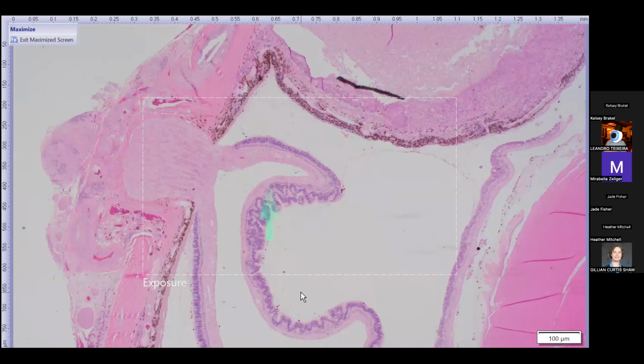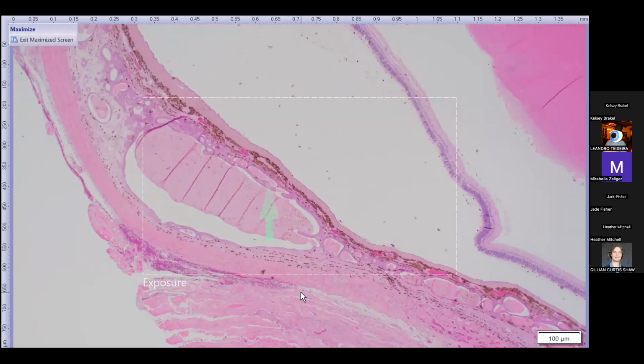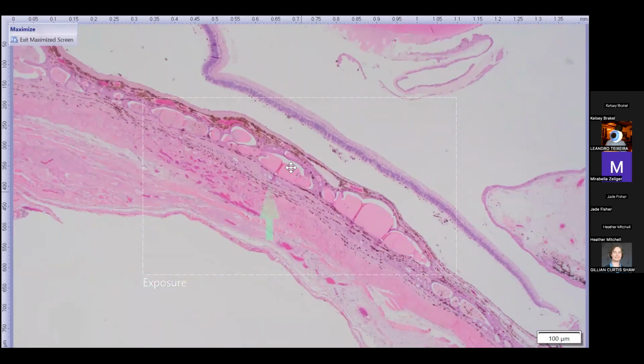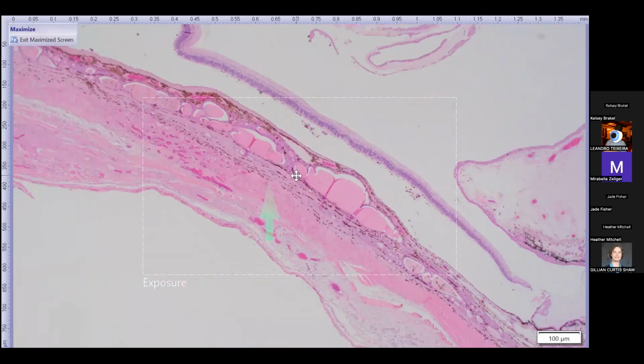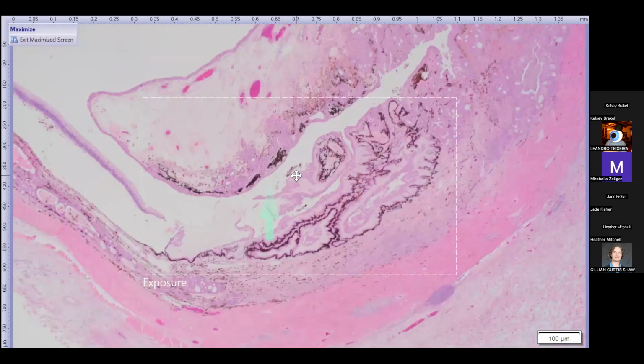So just giving you a tour around the globe. We've got it attached to retina as well. Here's similar tubules in the choroid and suprachoroidal space. And some of these tubules at this level have a little bit of proteinaceous fluid in the lumen. So it's homogeneous, it's pink, it's full of protein. So that was a tour around the eye.